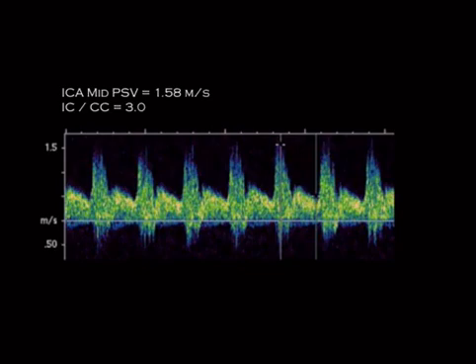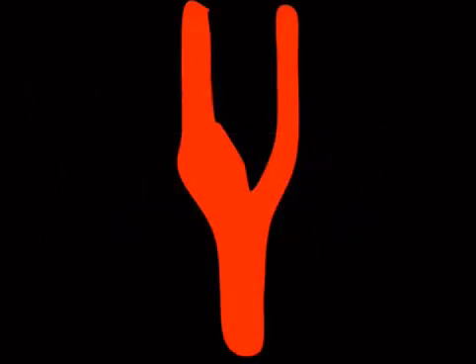A couple of things I want to point out. Notice how brisk this upstroke is. That's normal. That's what that's supposed to look like. When that's not there, that's abnormal. Anytime that a number is provided on the question, like as far as velocity, it's probably going to lean you towards a stenosis question. Now that'll be obvious once you see your choices, although they could throw some other random stuff in there.